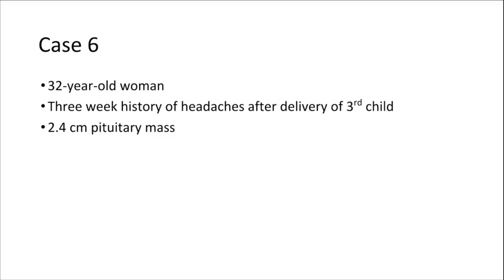Okay, moving on to the next case. Case 6 is a 32-year-old woman who had a 3-week history of headaches after delivery of her third child, and had imaging done, and they found this 2.4 centimeter pituitary mass.